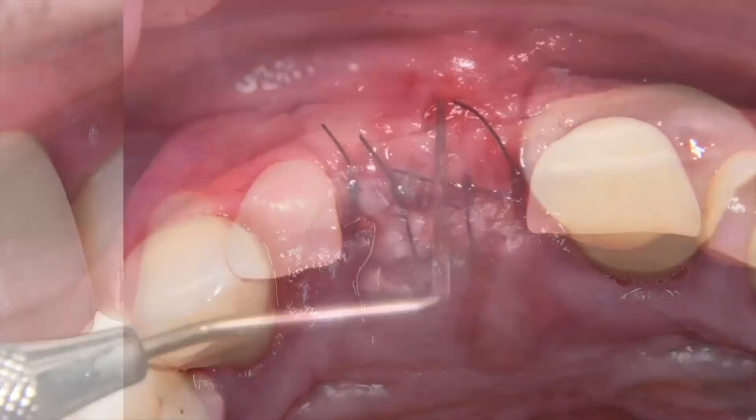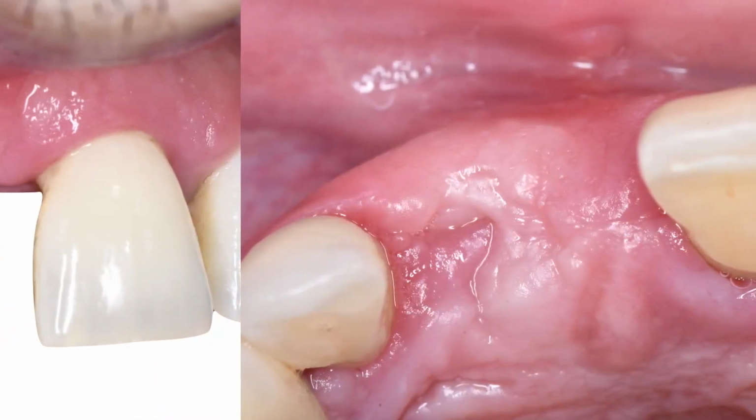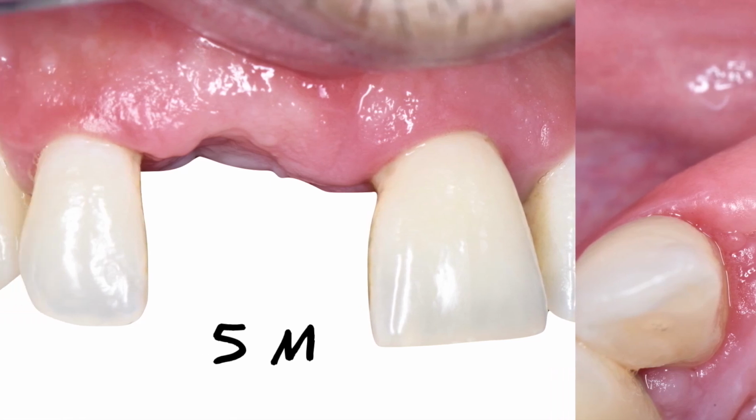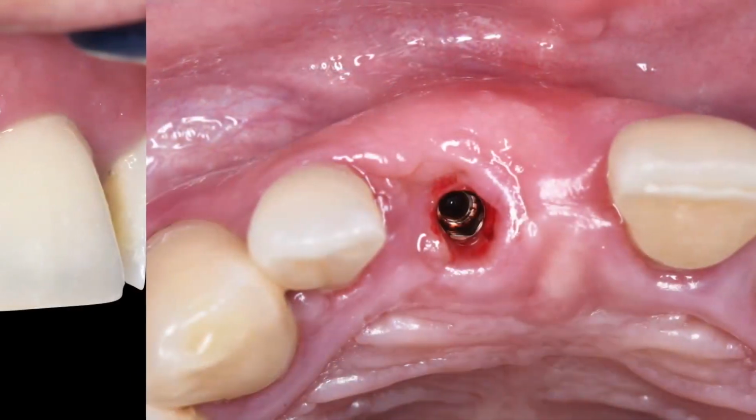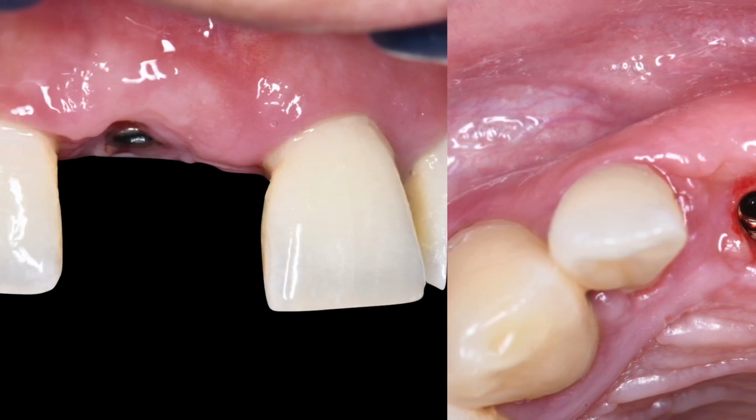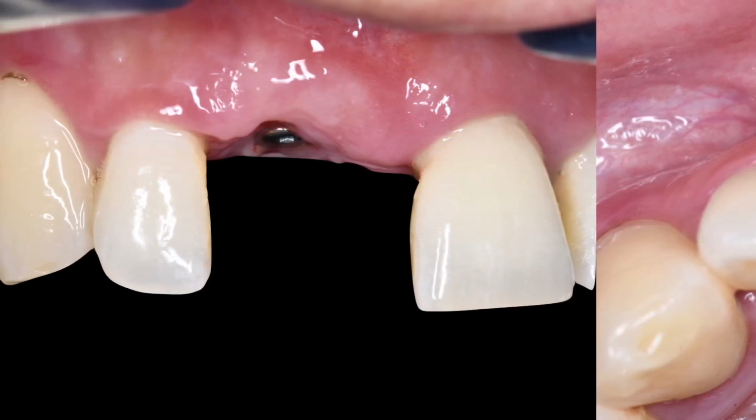And so this is the clinical situation 5 months after implant surgery, when we go to uncover the implant. We have reconstructed the soft tissue with keratinized gingiva correct in height and thickness, and we also radiographically reconstructed a correct profile of the bone tissue.